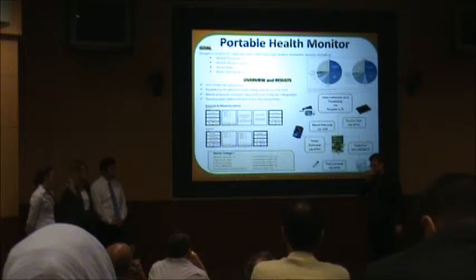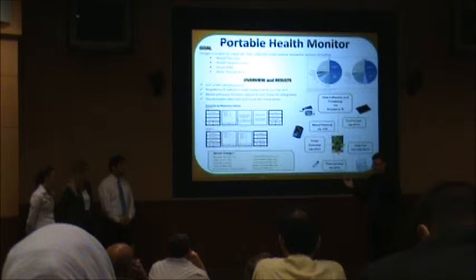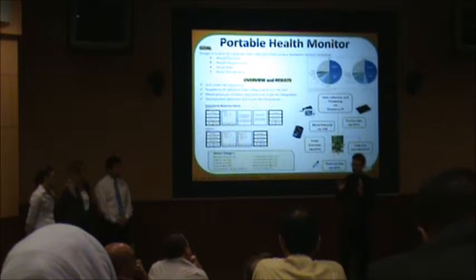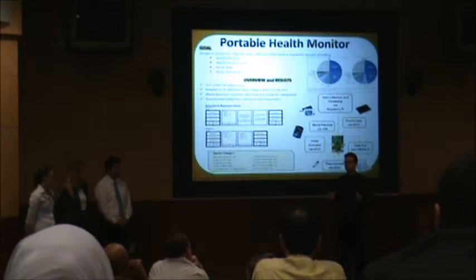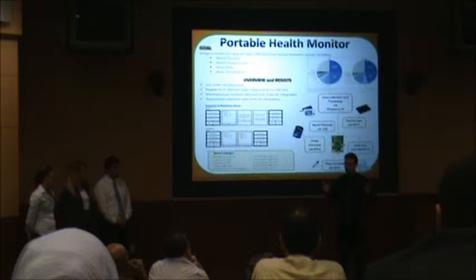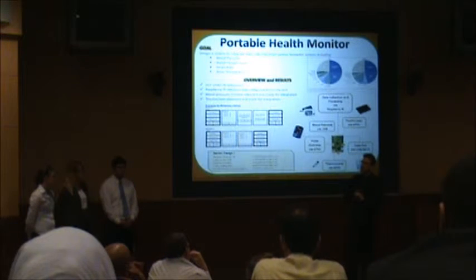Some of the challenges that we are facing, one of them right now is the tremendous programming involved with programming up our own graphical user interface. Also, size of the entire system and power consumption. We want to reduce that right now. What originally started out as a dream of a health bracelet has sort of turned into a monster of a prototype.